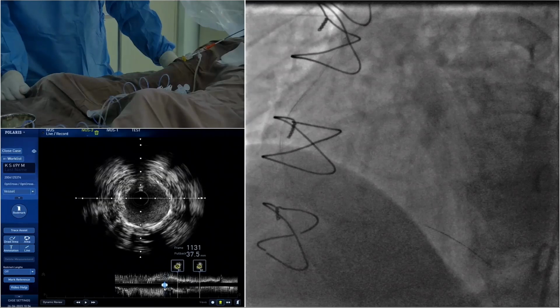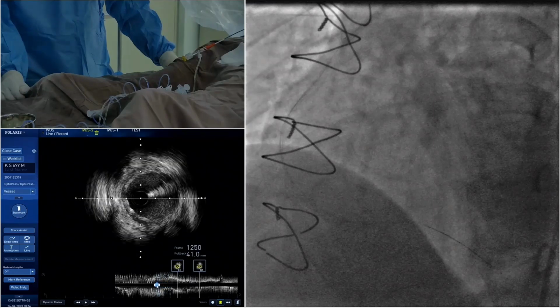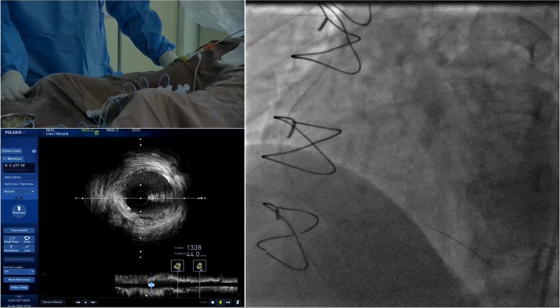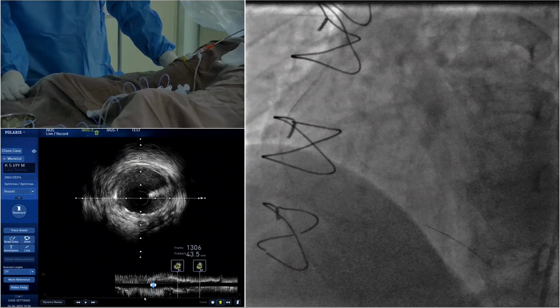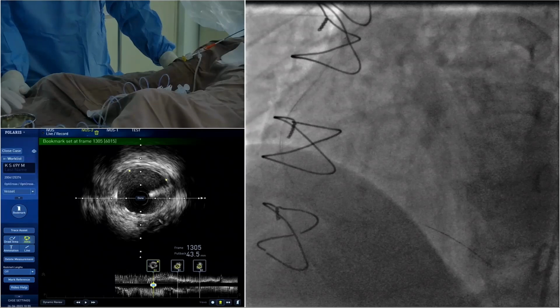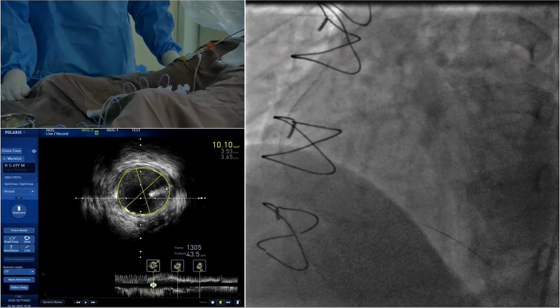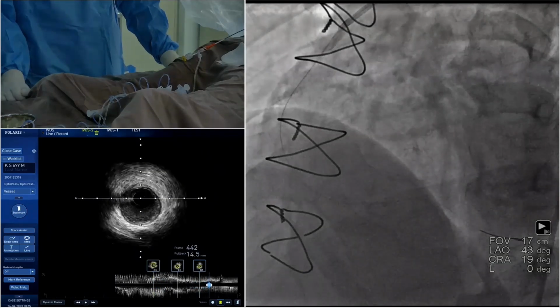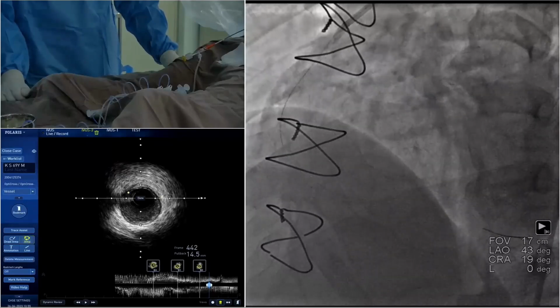And coming to the proximal, so obviously it was a 3.5 at the proximal portion of the vein graft, which is about 10. Good expansion. I think overall we've got a reasonably expanded stent. The distal diameter seems a bit low, about 5, but I think the vessel is small. It's only a 2.5 vessel. And I think we should be happy with this.